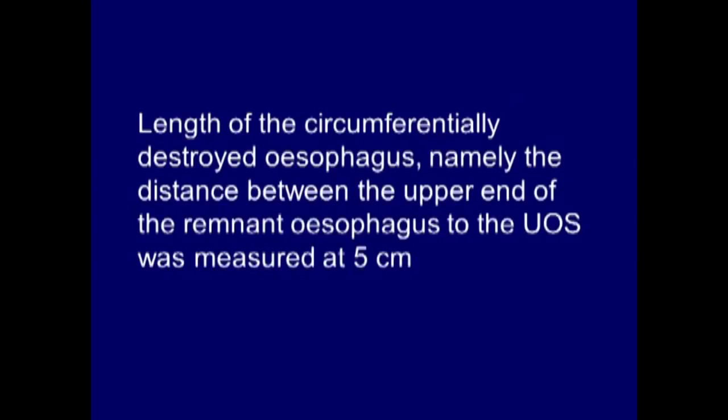The length of the circumferentially destroyed esophagus, namely the distance between the upper end of the remnant esophagus to the upper esophageal sphincter, was measured at 5 centimeters.